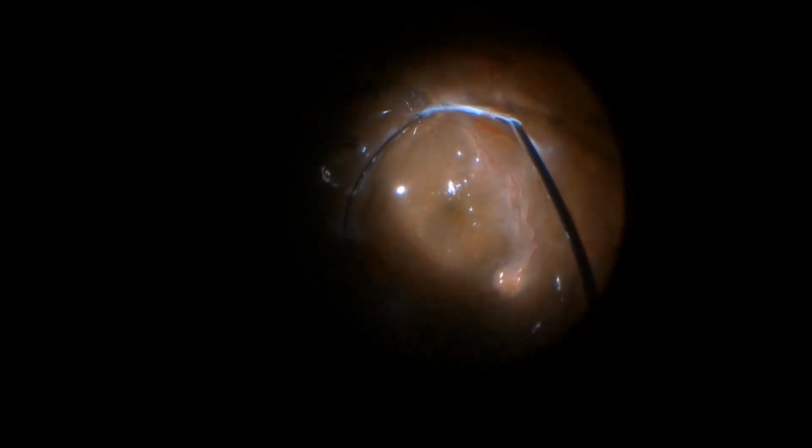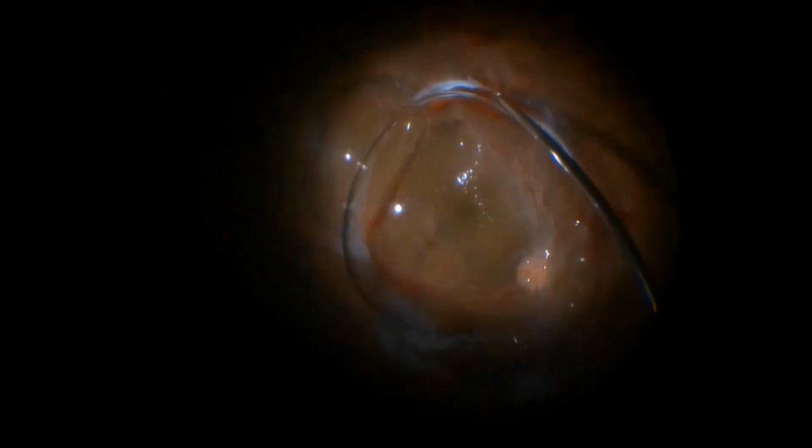Gentle dissection is being performed with the 25 gauge cutter only. As the posterior hyaloid face is separated from the retina, the PFCL further extends itself, seeps itself between the plane.